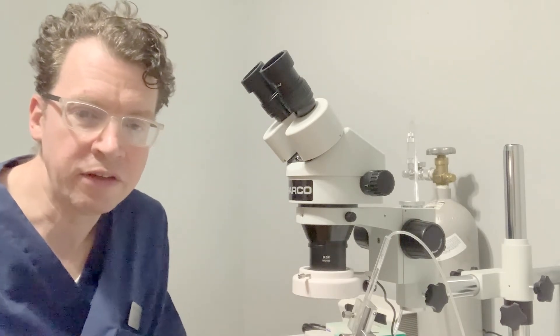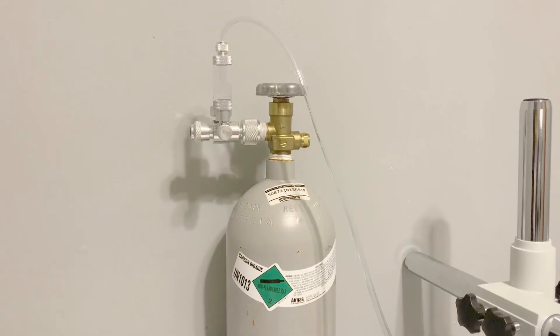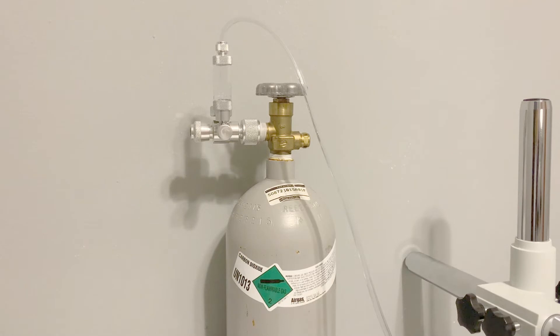Next, you will need a CO2 source. I purchased a filled five-pound tank from Airgas for $126. Airgas has locations throughout the United States. The regulator I am using includes a bubble chamber for administering the CO2. This regulator came with my instrumental insemination kit, and it fits directly onto the tank valve.